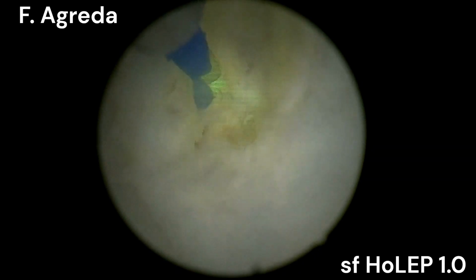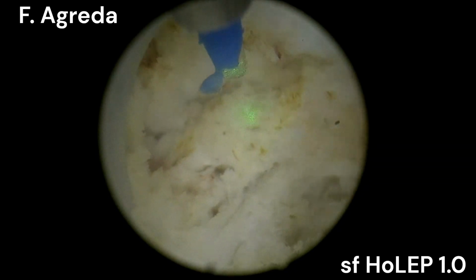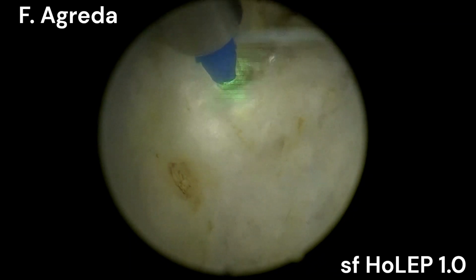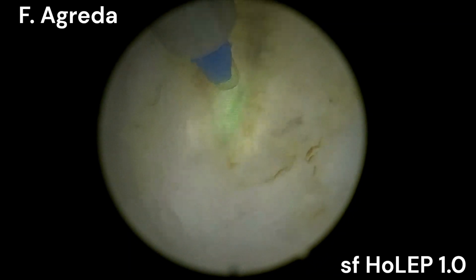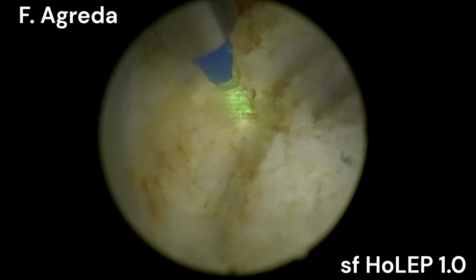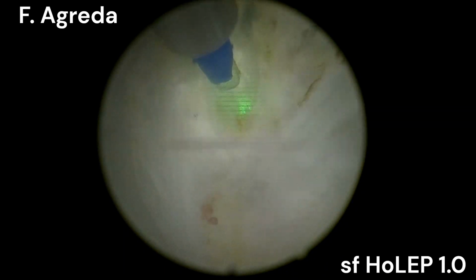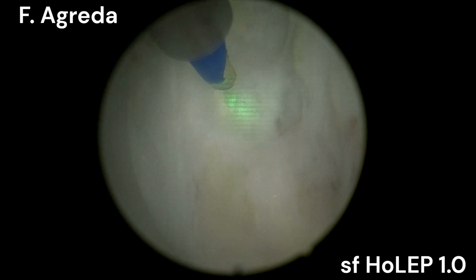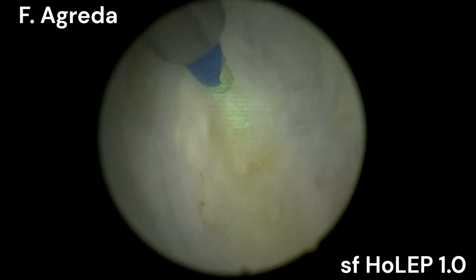With this kind of dissection, as you can see in the published data, I have achieved very nice, I would say very competitive, very good numbers in immediate continence and 1 month and 6 months rate of continence.